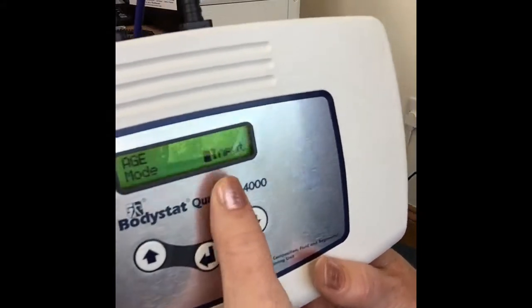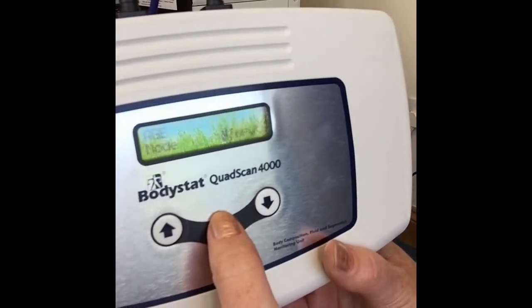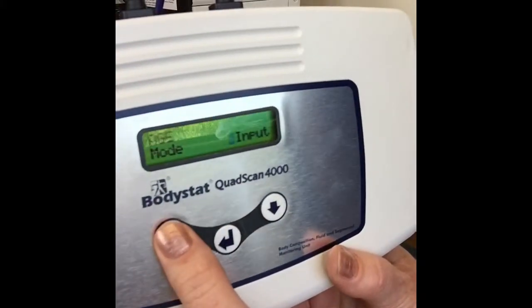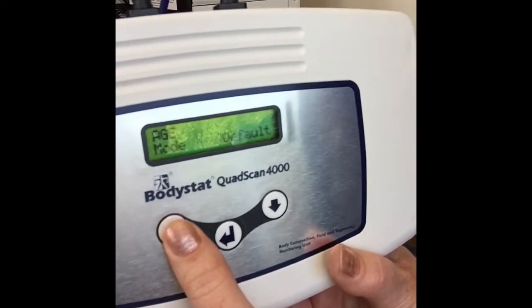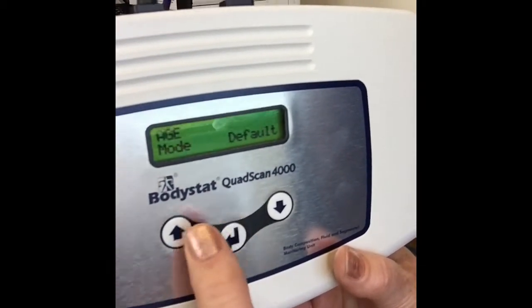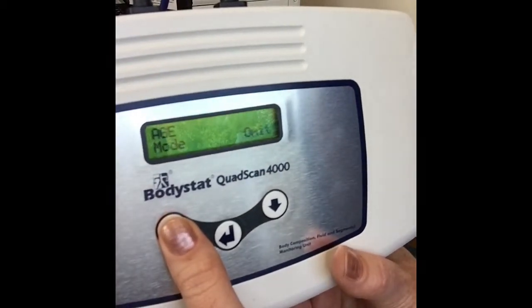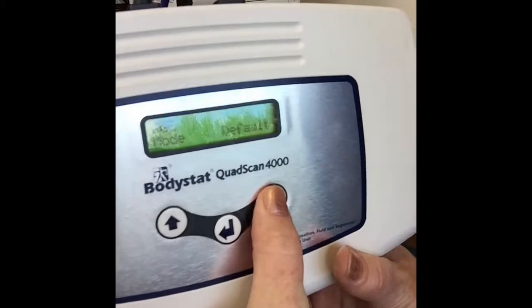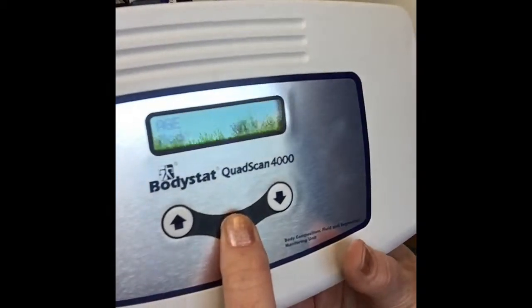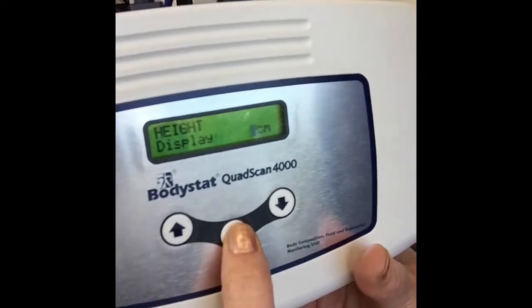When you press input, that allows you to change the age at the time of the measurement, so you can change it higher or lower — it just gives you flexibility at the time of the test. However, if your population group are all aged 50, you can default to 50 and it won't ask you to change the age. It's very rare to omit the age completely, especially if you're measuring body composition where you need these input data. So we'll keep that as input and move on to the next parameter, which is height.